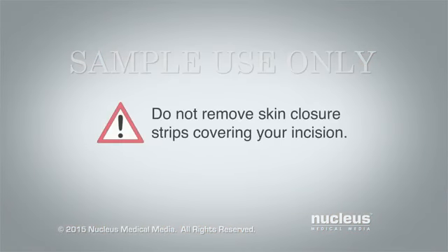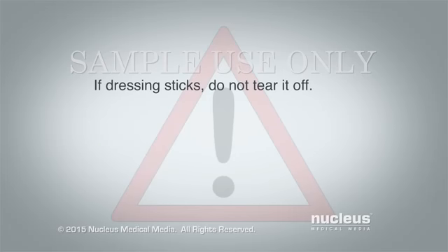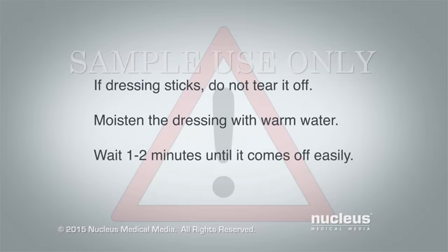Do not remove any skin closure strips covering your incision. Let them fall off on their own in about 5 to 10 days. If your dressing sticks to your incision, don't tear it off. Tearing it off may cause bleeding and delay healing. Moisten the dressing with warm water. Wait for a minute or 2 until you can easily remove it.